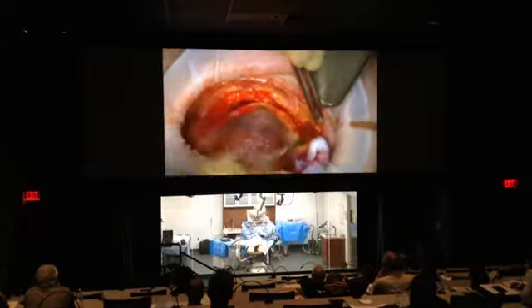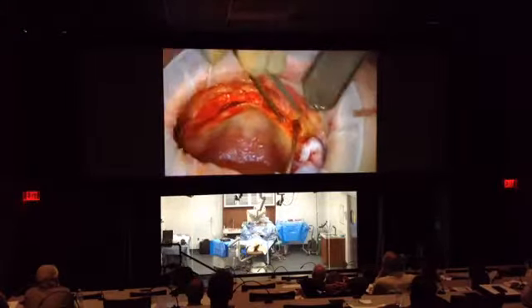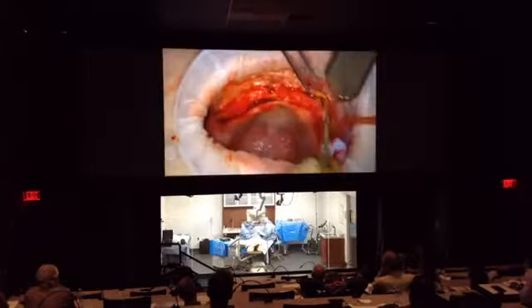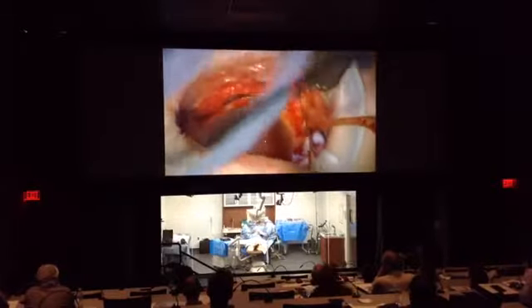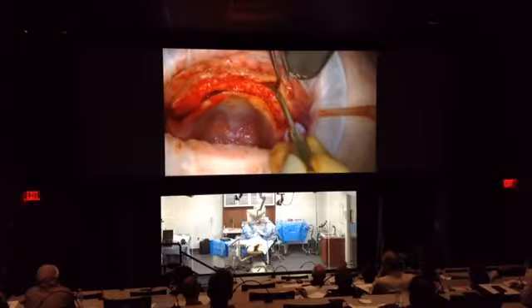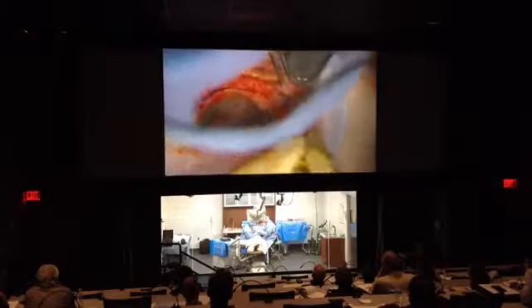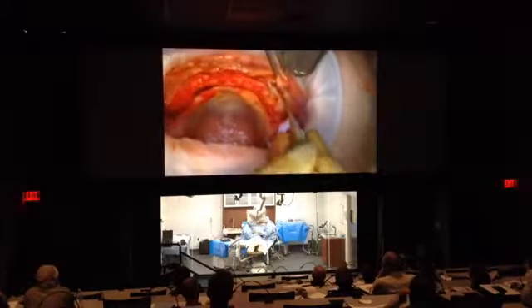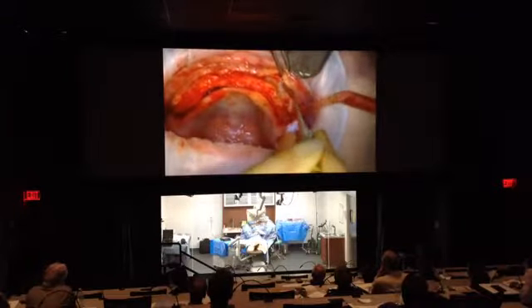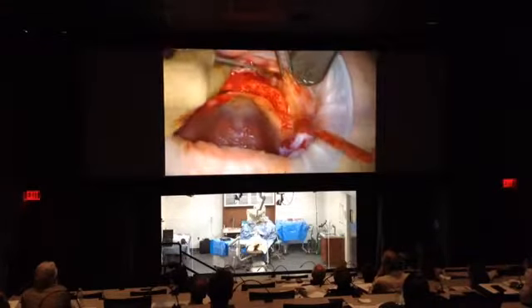Almost there. One more part right over the canine eminence here. I'm trying to keep the periosteum intact here, and so far we've been successful. The reason being, the periosteum protects all the vital structures, nerves, arteries, veins that are in the tissue, in the flap itself. So keeping the periosteum intact will get better healing.